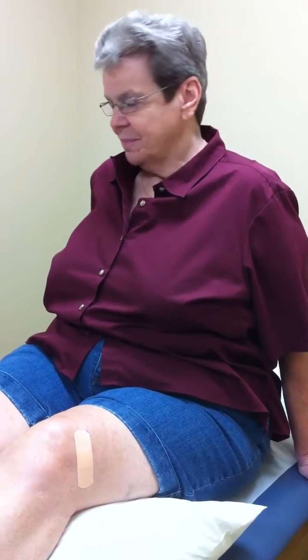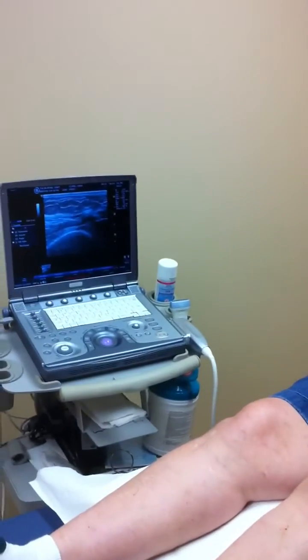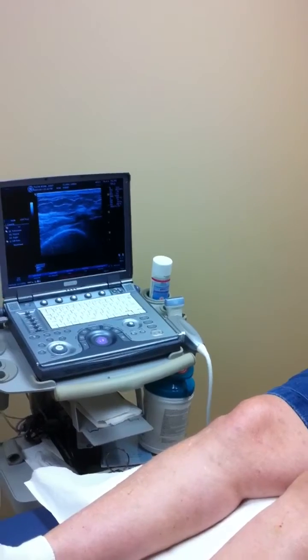We used OrthoVisc, which everybody calls the chicken comb or rooster comb type injections — that helps knees that have arthritis to help improve on pain. We've been using the ultrasound machine to make it a little bit less painful.